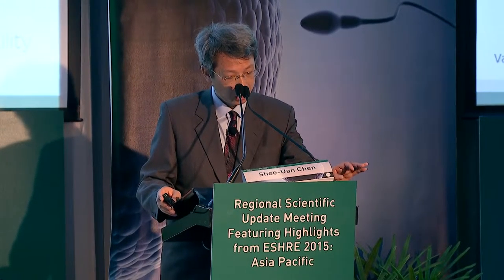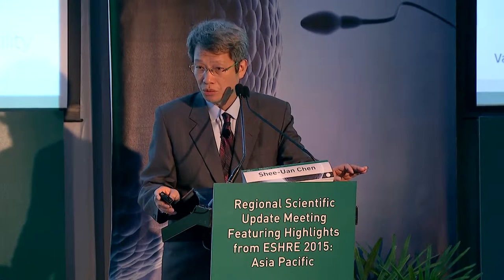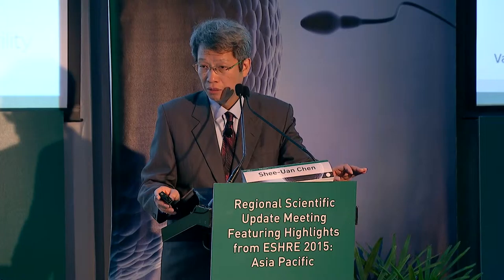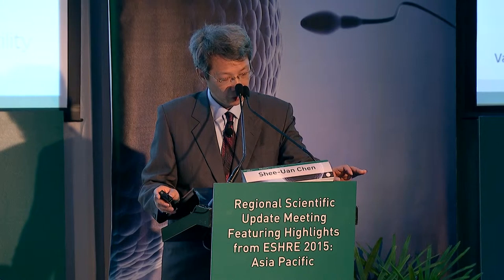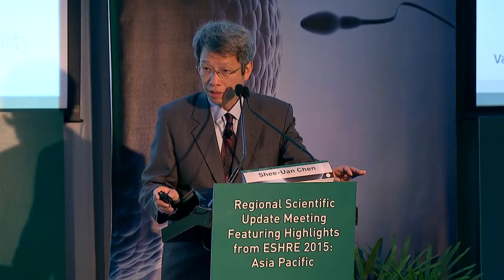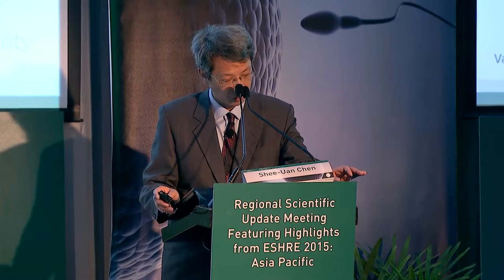Conclusions: 24 hours post-warming survival rates were similar for day 2 or day 3 embryos, but tended to be lower for blastocyst vitrification in a closed system. Vitrification with a high security closed system ensures high implantation rates after warm embryo transfer in an unselected patient group.